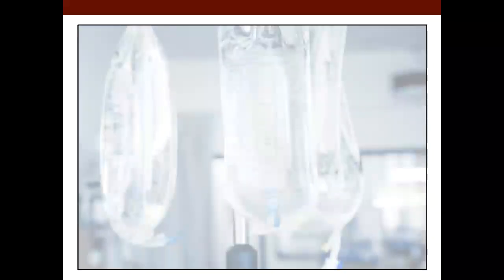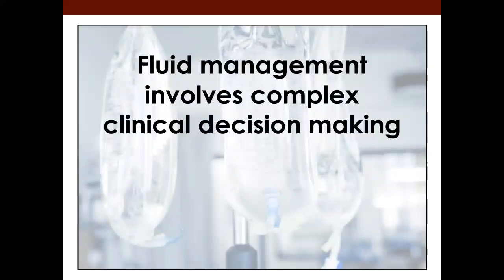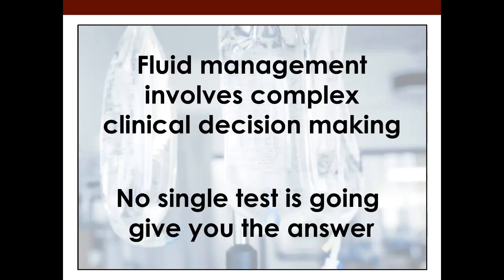But first, a disclaimer. Fluid administration is a complicated clinical decision, and none of us should be making any complicated clinical decisions just based on one test or number. And that's why I'm not going to try and convince you of the magical merits of any one ultrasound test that will allow you to just turn your brain off when you're managing your patient's fluid status. Because again, no single test is going to give you the answer. That being said, what we are going to try and do today is give you a big picture strategy for how you can use ultrasound in a systematic and focused way in combination with all of your other clinical data points to help you approach this complicated question.